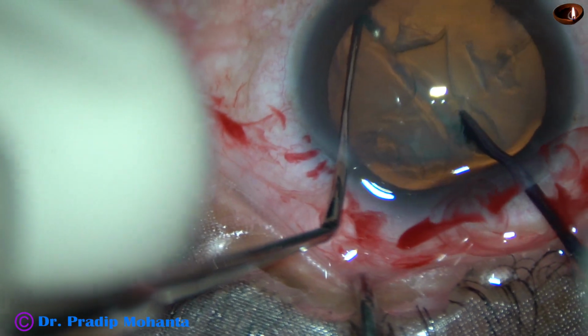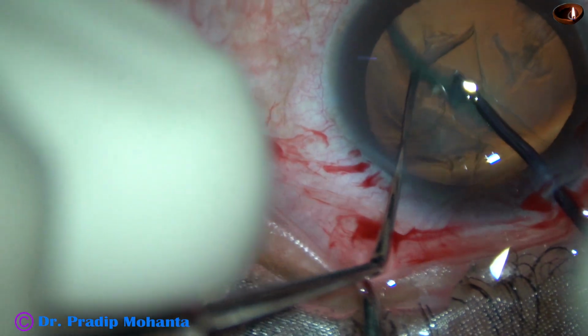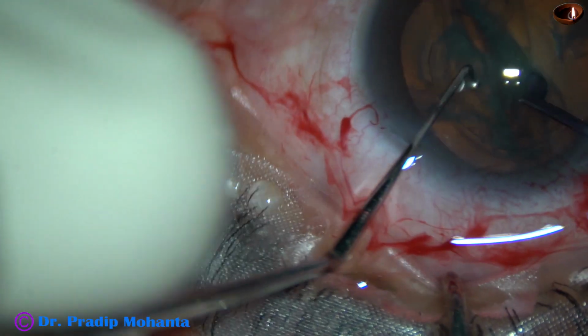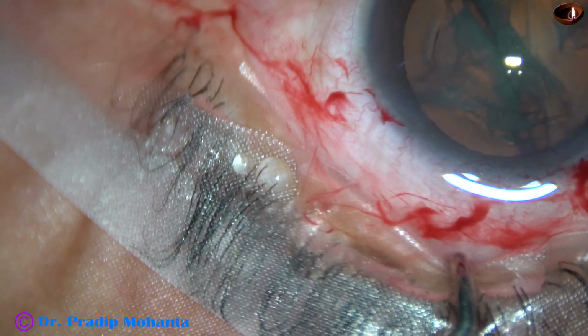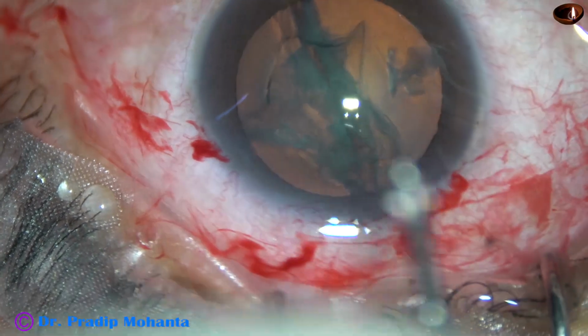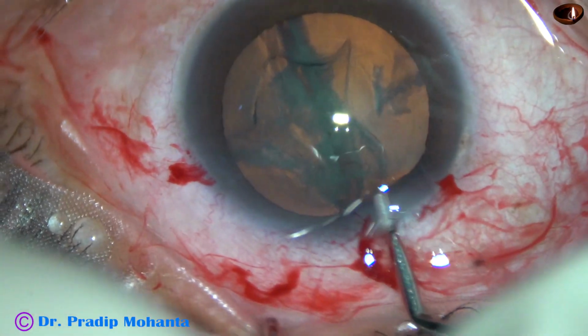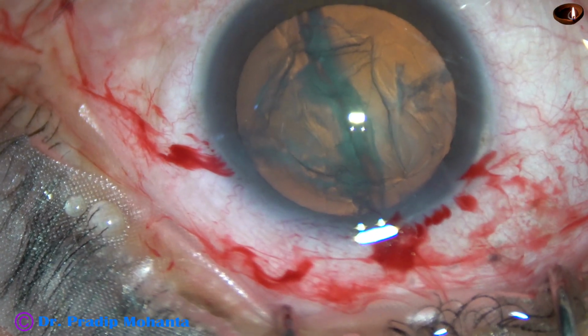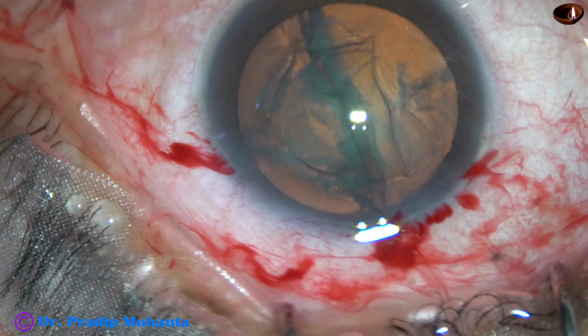And here it goes. The two instruments meet, and see how beautifully we can divide this soft nucleus. In a few seconds, the lens mass has been divided into almost two equal halves. If we use the stop and chop technique in this case, it will take at least 2 minutes to make a groove and then divide this nucleus into two halves.